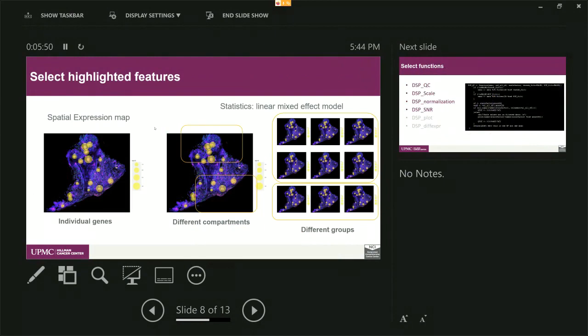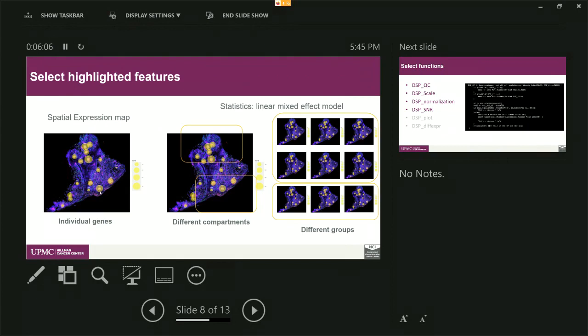So here are some highlighted features from our software. First one is we want to utilize the spatial distribution of the software which we actually allow people to visualize specifically on top of each ROI. We actually create the size of the bubble that represents the expression of specific genes. So we got this inspired by the COVID research. So we think we could actually apply the same concept on the pathology.